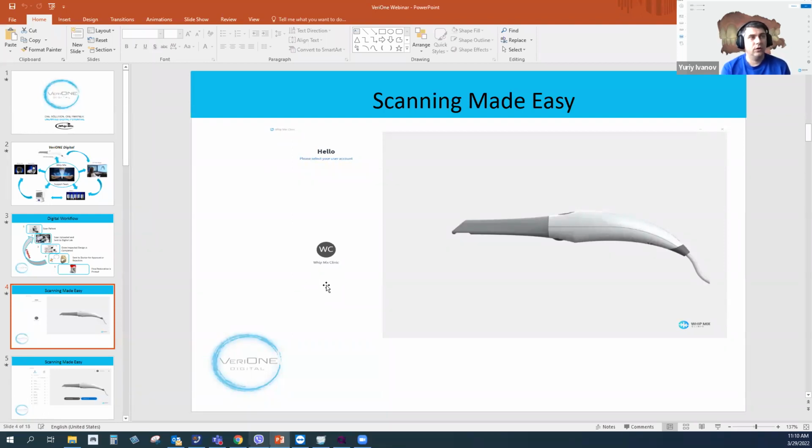from the mirror on the very end of this chip, which means the concept is really simple. It's the only scanner that has this patented feature to have a really easy and light scanner without any foggy time while scanning the patient's mouth.